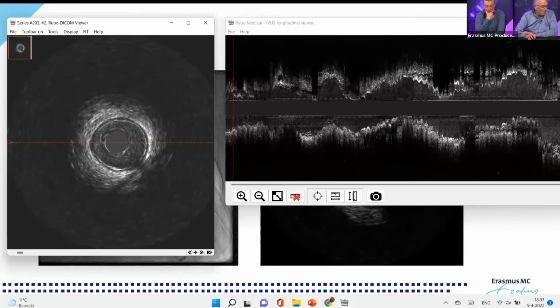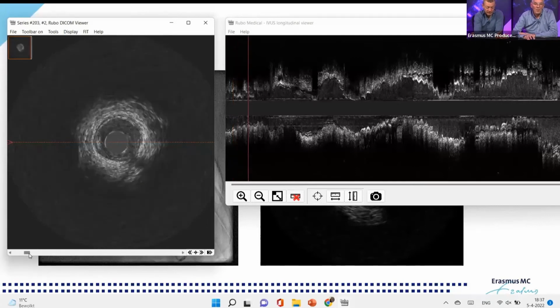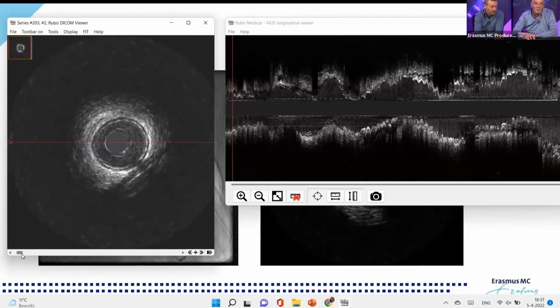I think that's a critical comment, Jürgen. And don't get me wrong, from a procedure perspective, doing the imaging should not be perceived as something difficult that takes time. I think from a procedural perspective, we really improved with these new technologies, but at the end, it's an imaging modality which only has its use if you look at the images. And of course, it's important that you can have your acquisitions quickly.